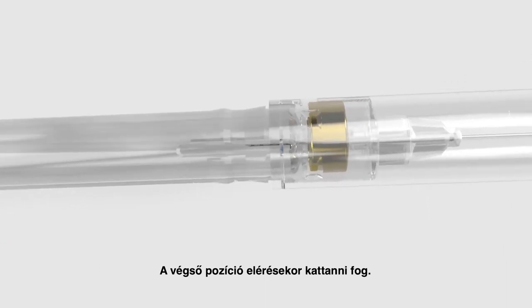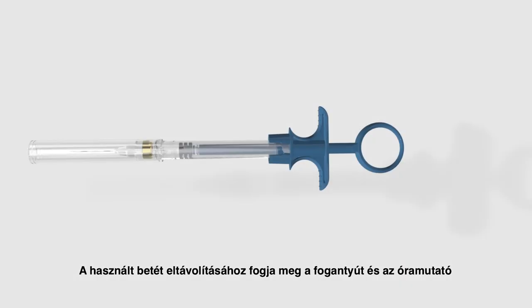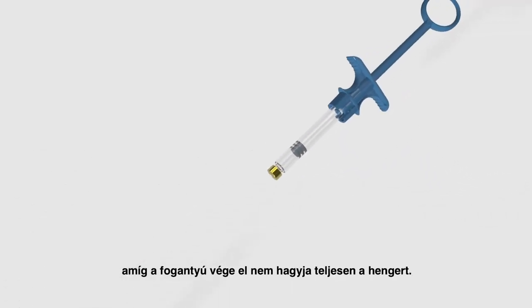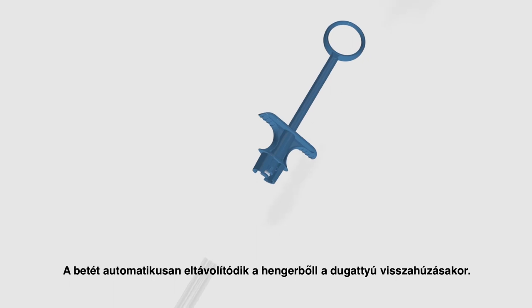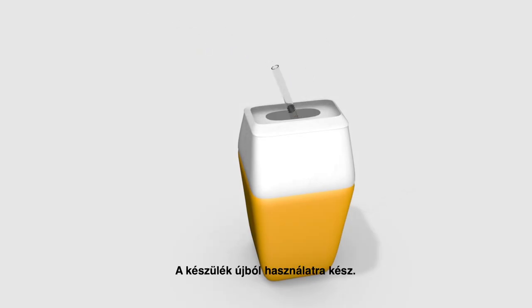It will click when the final position is reached. The device is now safely locked. To remove the cartridge for disposal, grip the finger holder, turn counter-clockwise and pull until the pins escape from the notches. The cartridge will be automatically extracted from the barrel when the plunger is withdrawn. The device is now ready for disposal.